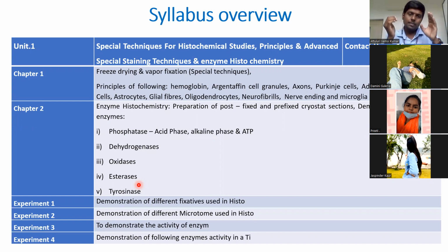Now my idea is, I will block this enzyme. If I block this enzymatic activity, this enzyme won't get involved in the pathway, so I will get the right answer. If this enzyme keeps on working in glycolysis, then I cannot assess the functional activity of the enzyme.